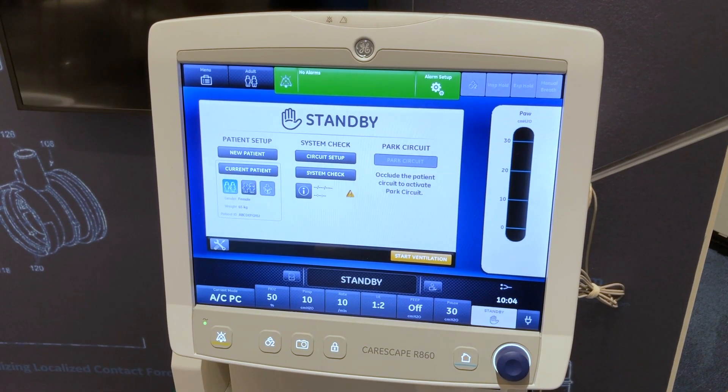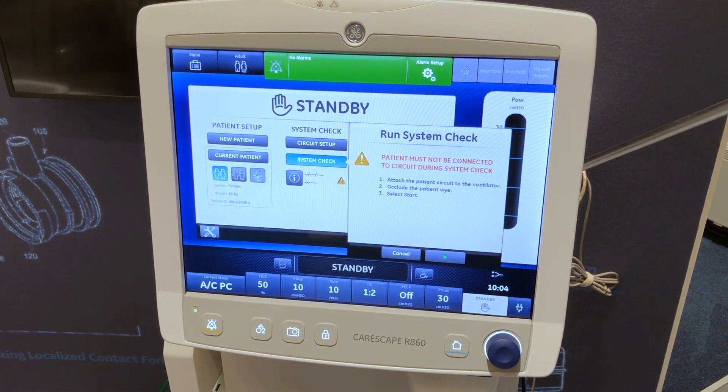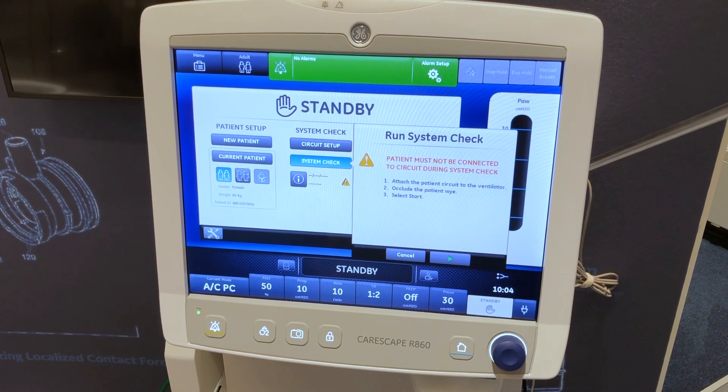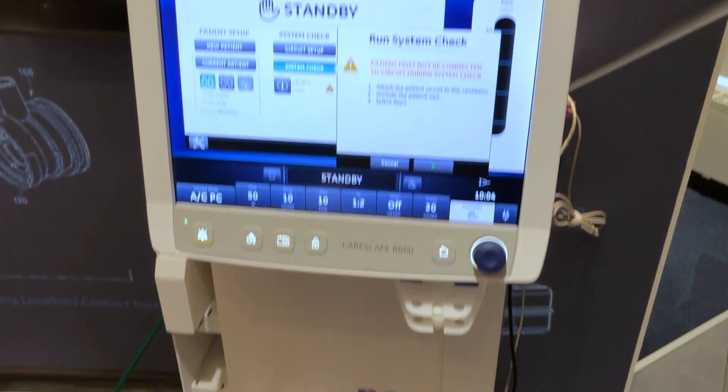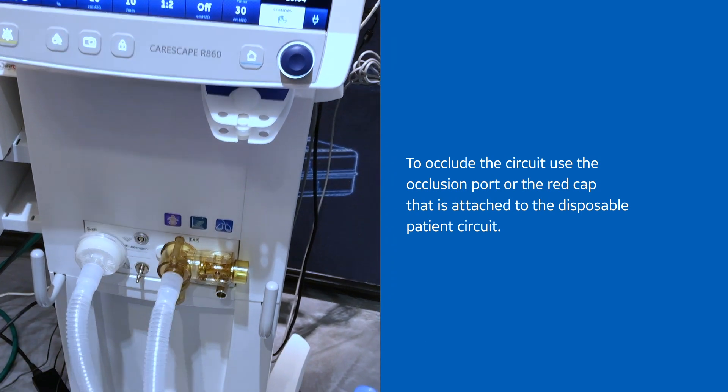Next, select system check. Follow the on-screen instructions. Attach the patient circuit to the ventilator. Occlude the patient Y. The occlusion port sits below the exhalation valve assembly.